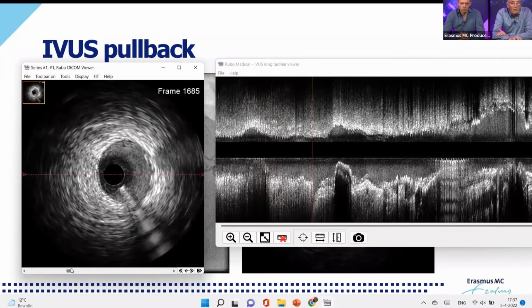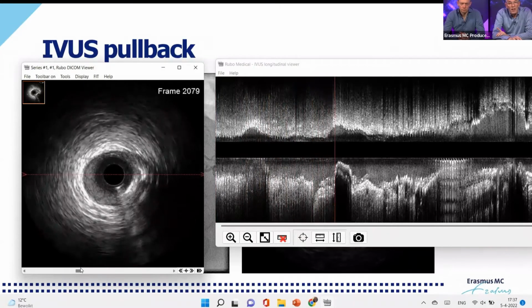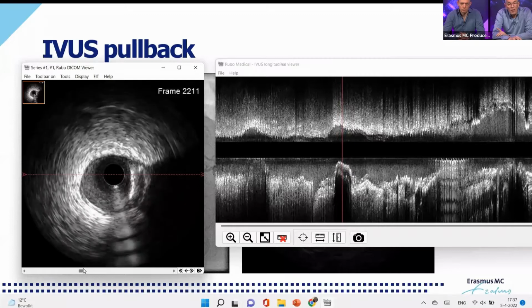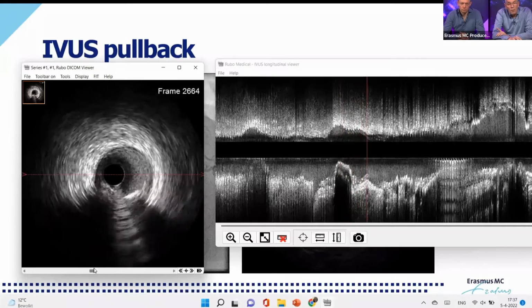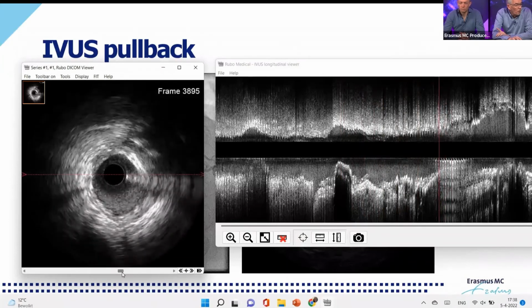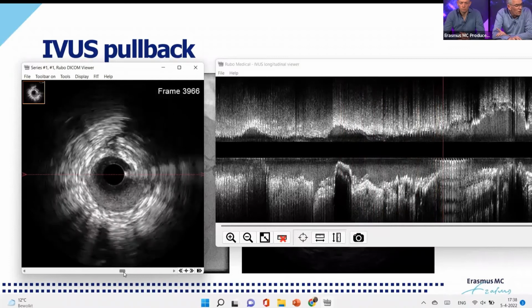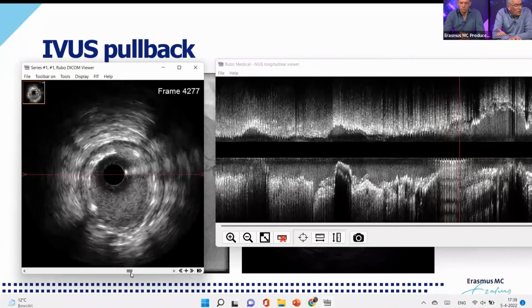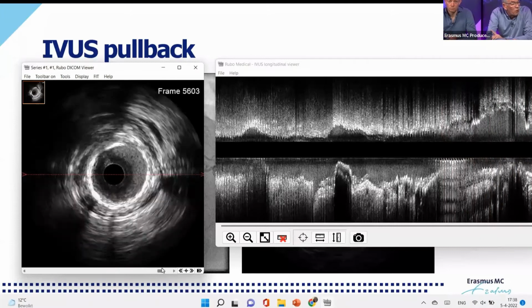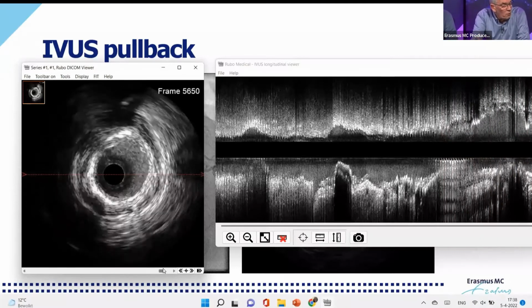Again, a region with a normal vessel. And here we see a calcified lesion at 3 o'clock with also a smaller lumen. So as we proceed, then we reach the old stent. You can appreciate the stent struts in here, in the old stent. And we see here we have minimal hyperplasia. That's not bad. And we reach here the proximal LAD. And at the end, at this spot, we also have a smaller lumen approximately in the stent.